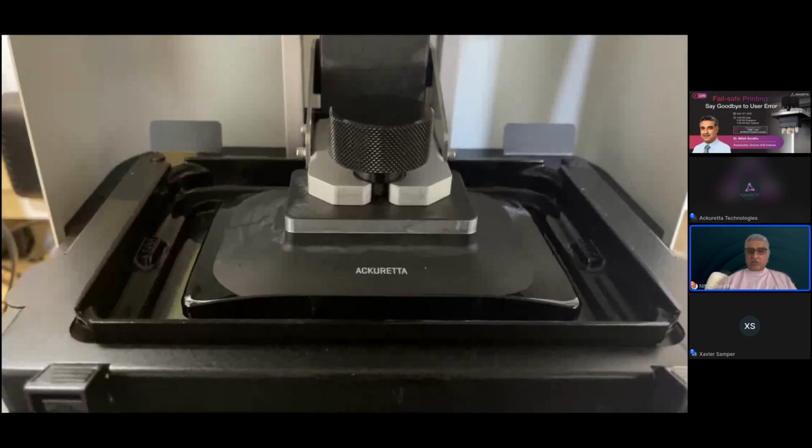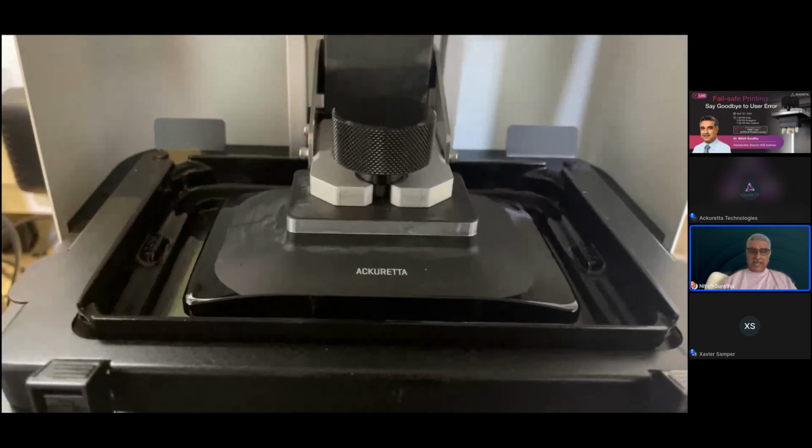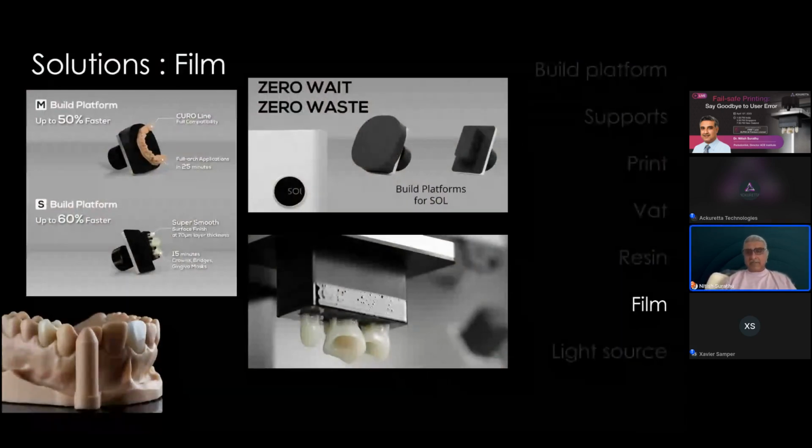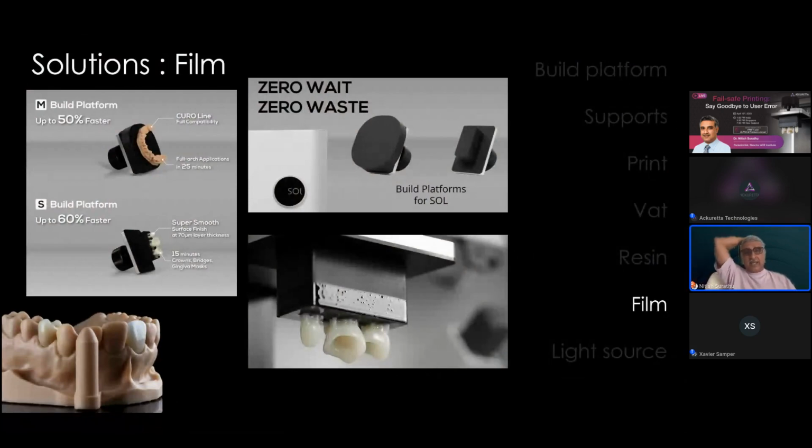That click is what we call peel force. And it's an immense amount of force for the platform to have to detach the layer of resin that's just printed. But it was nice to just get an audio recording of what a click is actually like, and what peel force actually sounds like. And that's something that you can encounter when you're printing if you put your ear to your printer. Again, think about using smaller platforms. Think about using purpose-driven platforms because they help the film as well.